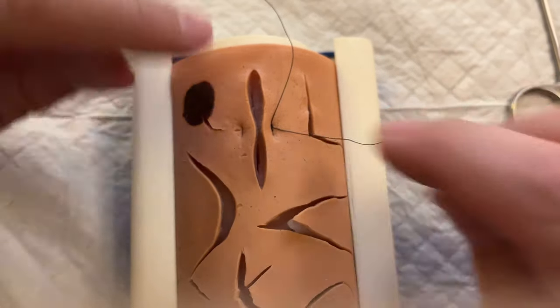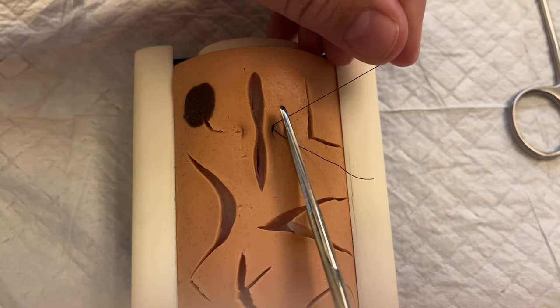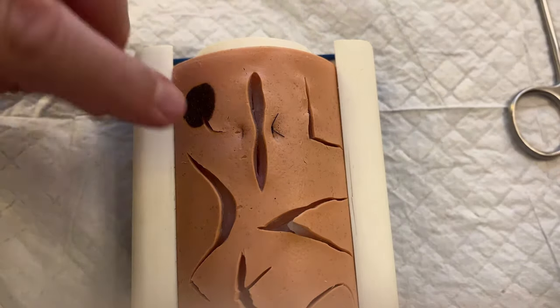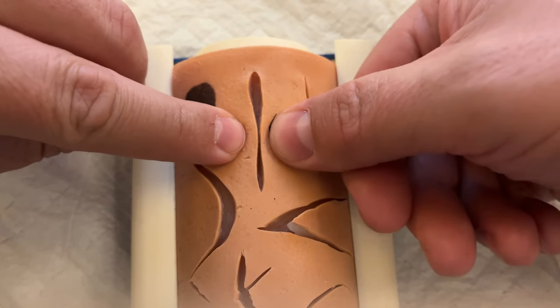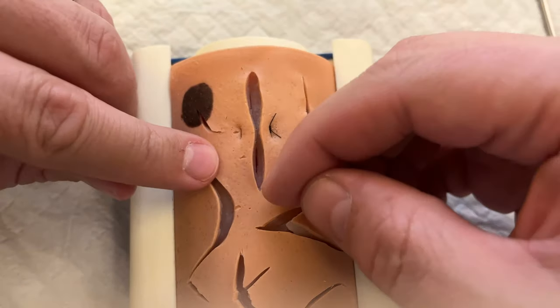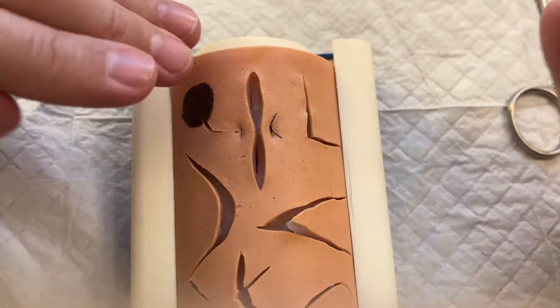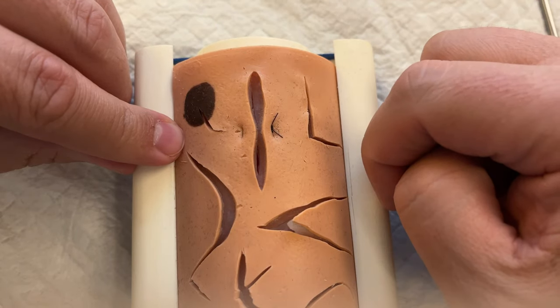Once the edges are together, you now have less tension and can close the rest with something like a simple interrupted or a different technique. I don't love the horizontal mattress suture because it's fairly easy to strangulate the skin, but it works well to pull large gaping lacerations or incisions together to get started with the skin edges closer. I'll oftentimes cut the horizontal mattress suture out after using it initially to pull a large gaping laceration together.